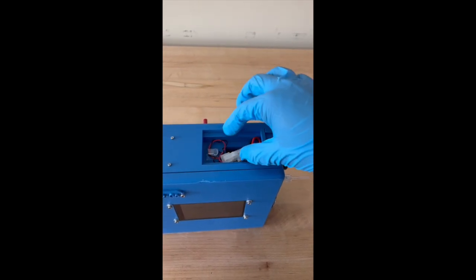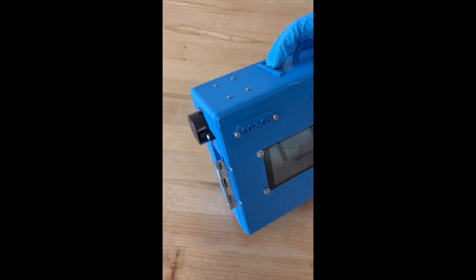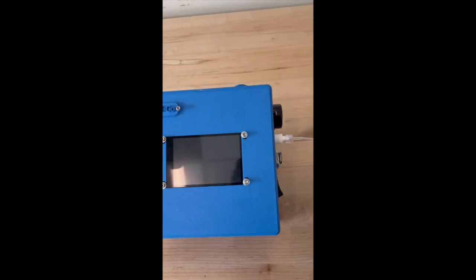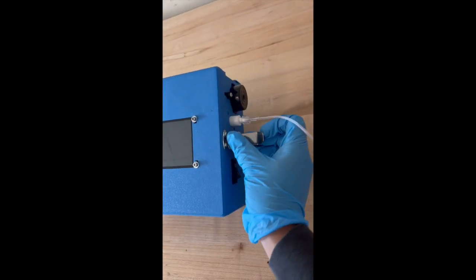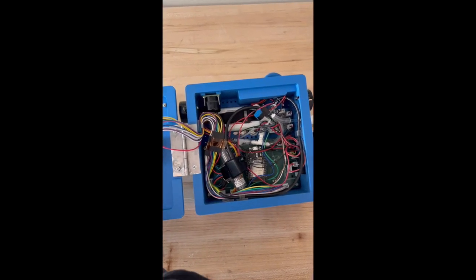On the top of it, you can see a little battery drawer where you can open up the slot and see the actual connection point where you can charge the battery if it goes low. And on the right, you can see the toggle latch, which you can open in case you need to access the internal parts of the device, which look like this.